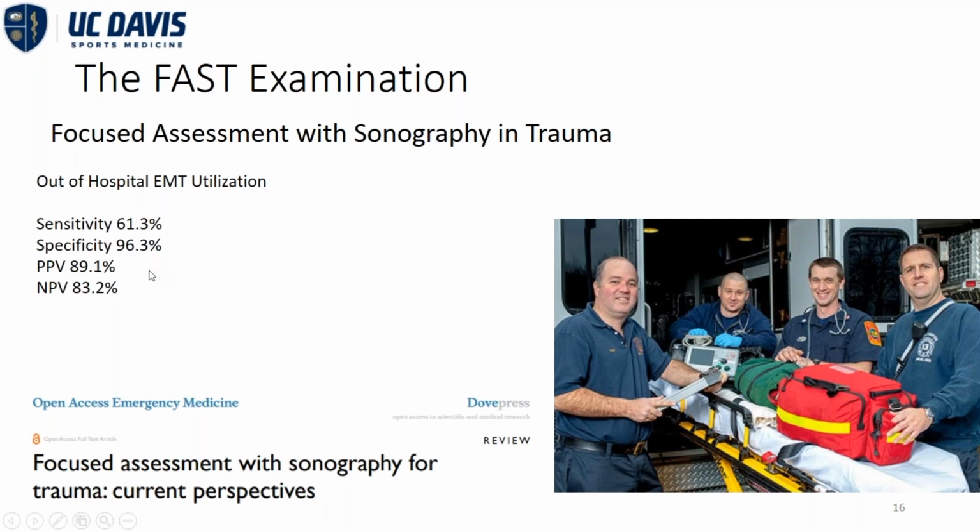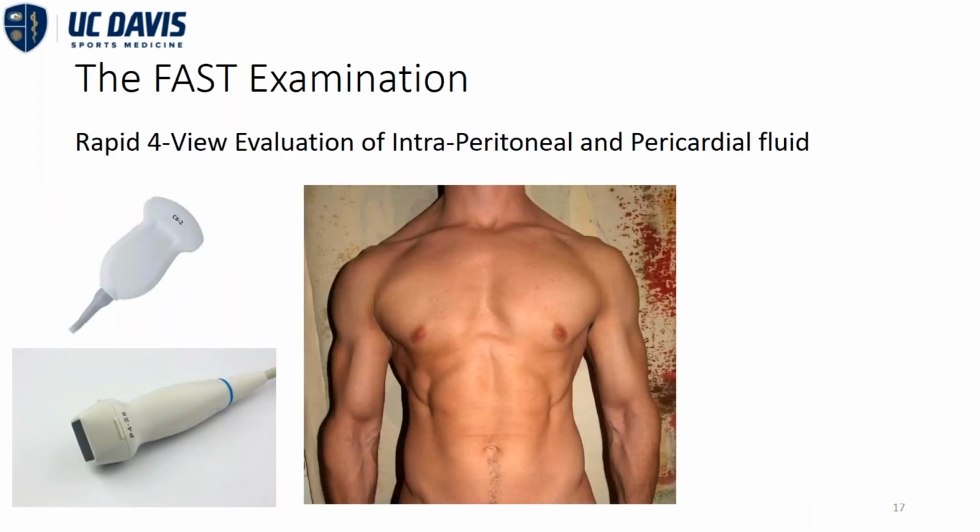Specificity still is very great. And then the positive predictive value, when you see free fluid, that's very likely to be blood. And the negative predictive value is also pretty great. So in untrained, non-medical experts, I mean, this is pretty good stuff. So please have a lot of confidence moving forward with using this on the sideline ultrasound.